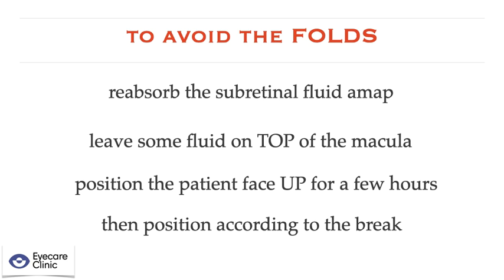So in the end, my final advice to avoid the folds is to reabsorb as much subretinal fluid as possible, leave some fluid on top of the macula, position the patient face up for a few hours, and then position according to the break. Thank you.